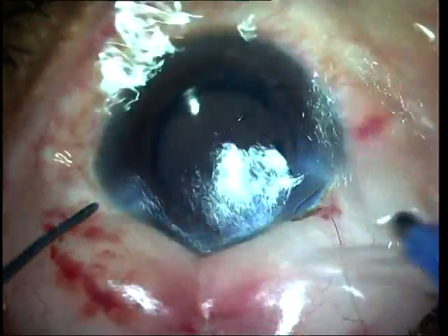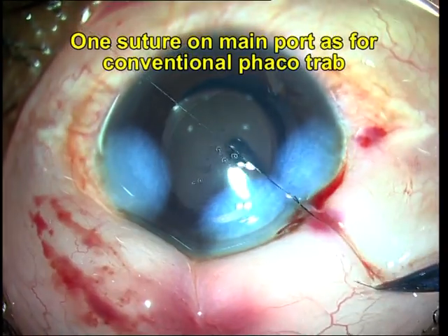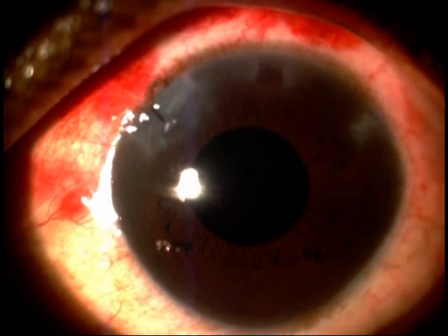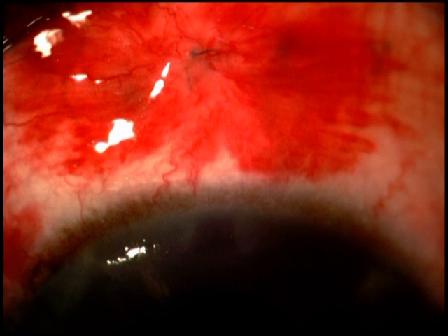The advantages of this surgery are that there is only a single 2.8 mm incision in the conjunctiva and absolutely no sub-conjunctival dissection, which therefore decreases the risk of failure from scarring to a great extent. The amount of virgin conjunctiva for any future procedures if required is much more than if a conjunctival flap had been raised, as in other techniques. The creation of the tunnel is easy and one step.